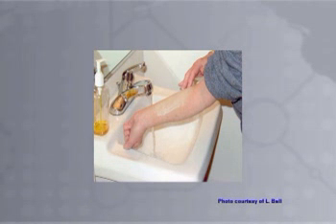Kedoki recommends that aseptic technique be used for all cannulation procedures. The best way to prevent an infection is to follow your unit-specific infection control policy and procedures. Proper infection control measures work only when practiced every day by all patients and all staff members. Deborah? That's right. Patients should wash the skin over the access with an antibacterial soap before coming to the dialysis chair. Once the patient has washed, you select the needle sites before applying an antimicrobial agent.